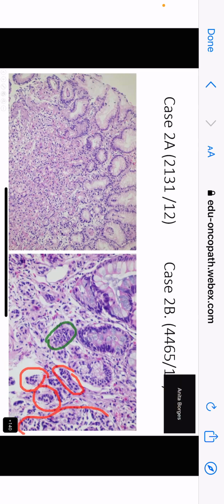So Dia sees nests. Vimi, did you see the nests? Yes, ma'am. Not only that, you can see these nests prominently at the surrounding of some of these mucinous glands of the gastric antrum. All right. So there, you have nests over there, and they have these very dense looking nuclei. Okay. The cytoplasm is not very conspicuous, and so you can't say anything.